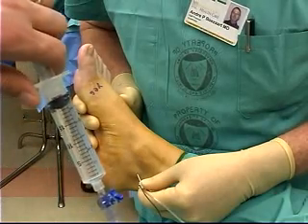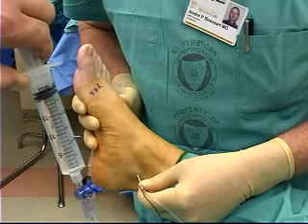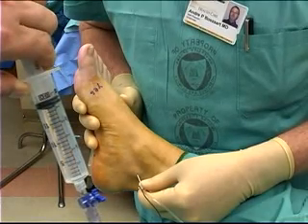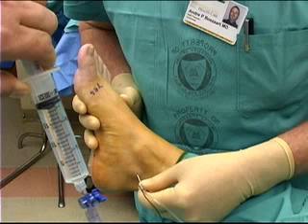The nerve stimulator is now turned down so that the brisk motor twitches of the toes can still be observed at a current output of 0.3 to 0.5 milliamps. This may not be possible in diabetic patients due to diabetic neuropathy, where much higher currents may be required. The motor response will immediately cease upon injection of local anesthetic agent.